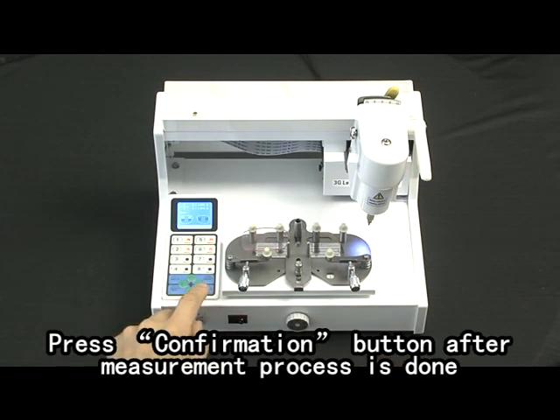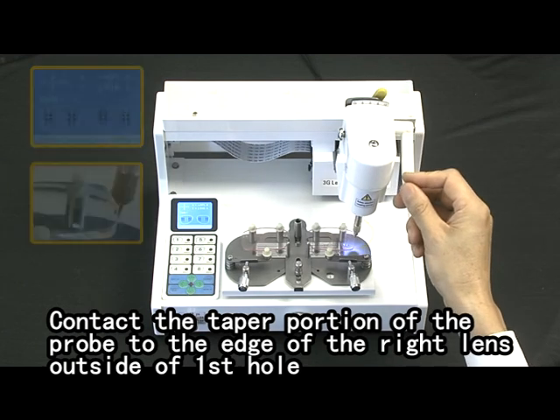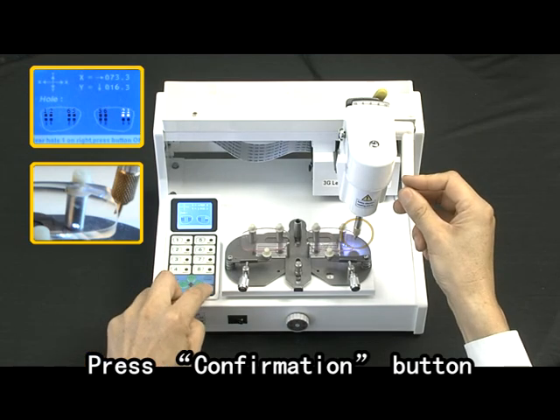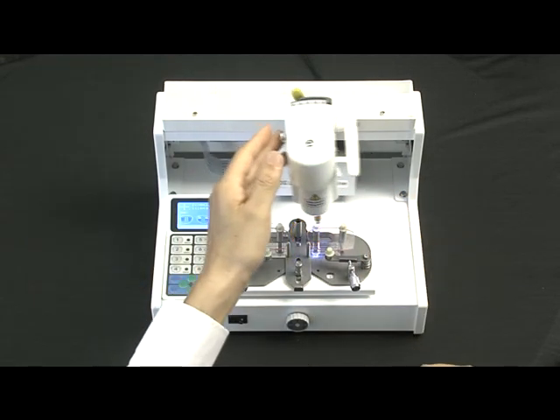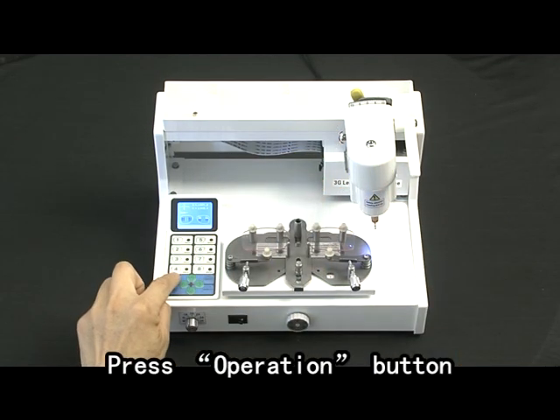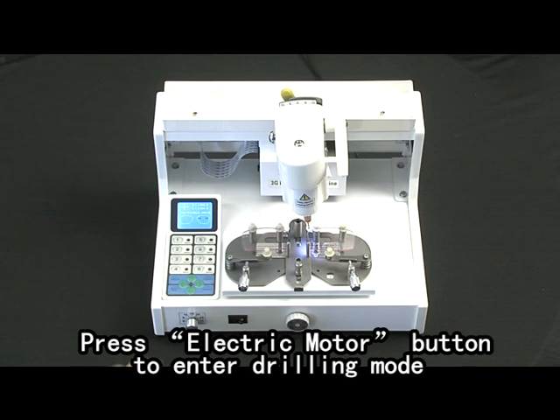Press the confirmation button. After the measurement process is done, remove the probe and load the needed drill bit. Press the operation button and contact the taper portion of the probe to the edge of the right lens outside of the fifth hole. Press the confirmation button. Tilt the head to the left. Contact the taper portion of the probe to the edge of the right lens outside of the fifth hole and press the confirmation button. Remove the probe. Load the needed drill bit. Press the operation button. The head moves to the fifth hole of the right lens automatically. Press the electric motor button to enter drilling mode.